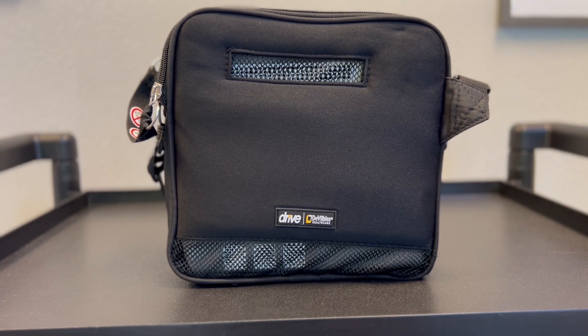This week we're going to talk about the new portable oxygen concentrator that Home Oxygen is carrying — the Drive DeVilbiss iGo 2. The iGo 2 is one of our lightest concentrators, coming in at under five pounds, and delivers up to five liters of oxygen flow.